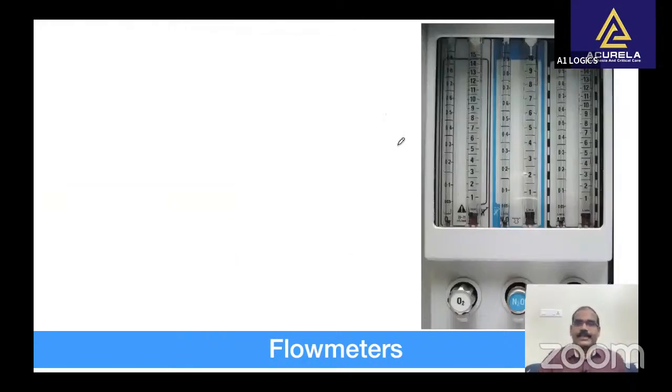Here you can find the knob for oxygen, which is color coded white, fluted and larger in diameter than the other gas flow control knobs. The nitrous oxide control knob is smaller, blue in color and ridged, but not fluted like the oxygen knob. Positioning of the oxygen flow meter in the bank of several gas flow meters is important.